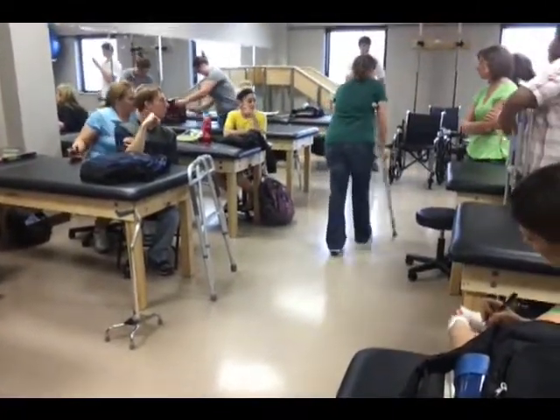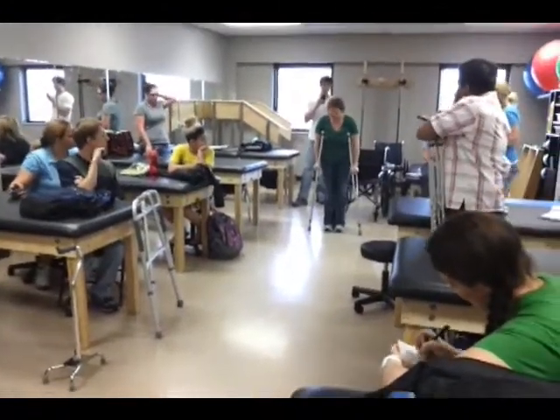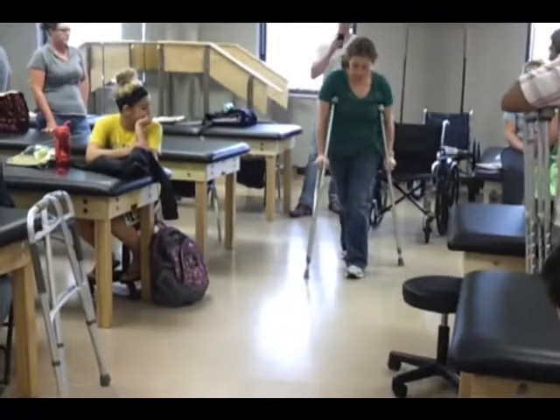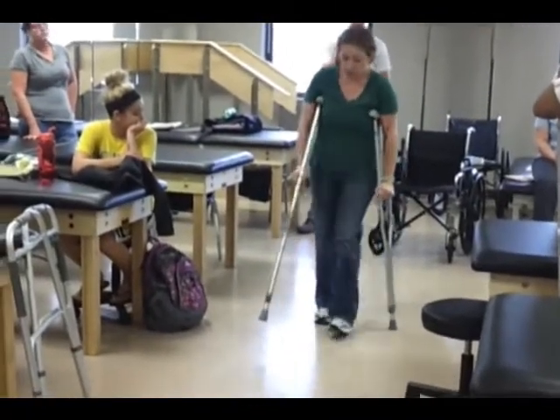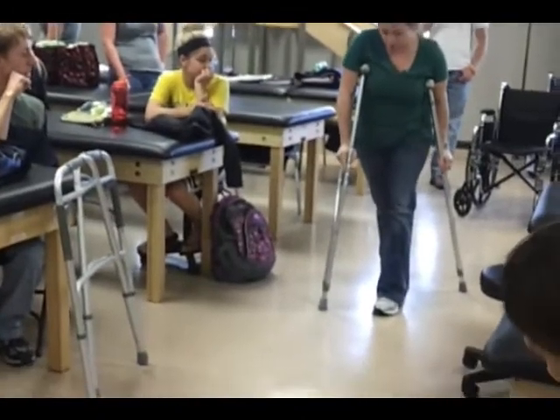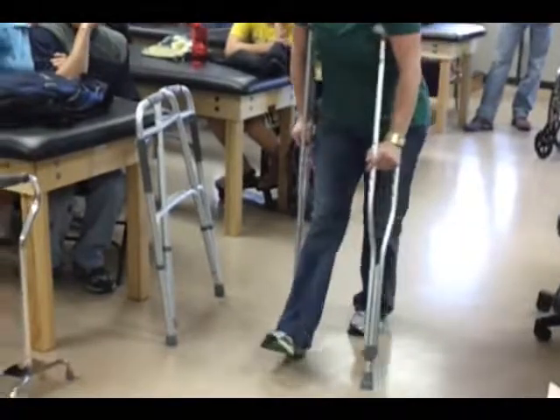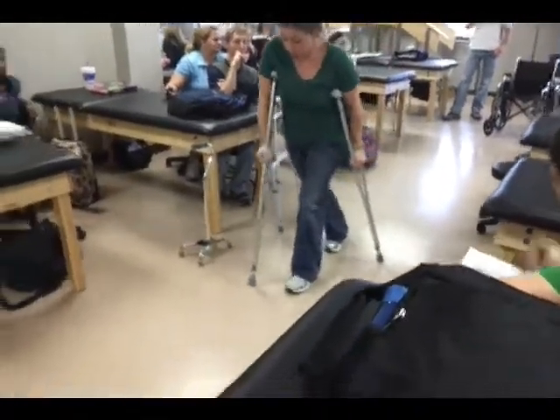Arm, leg, arm, leg. Now, if I have this, what gait pattern is this? 2-point. Why is it a 2-point? I'm advancing my crutch and my opposite foot at the same time. Exactly. That's the difference between the two. So there's my 2-point.